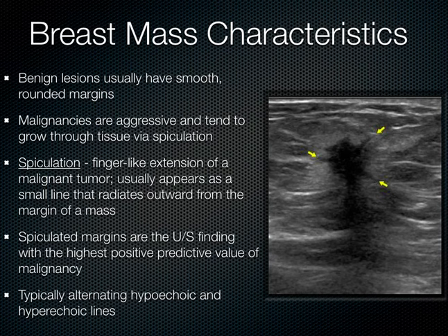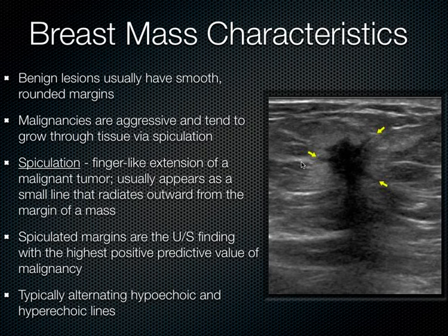The various characteristics that help us differentiate benign from malignant lesions include the margins. A benign lesion has a nice, smooth, rounded margin, whereas malignancies tend to grow through tissue layers through spiculation — finger-like extensions of the malignant tumor. These spicules look like small lines going outward from the mass. Spiculated margins actually have the highest predictive value for a malignant tumor. Sometimes you'll see alternating layers of hyperechoic material with these hypoechoic spiculating lines.